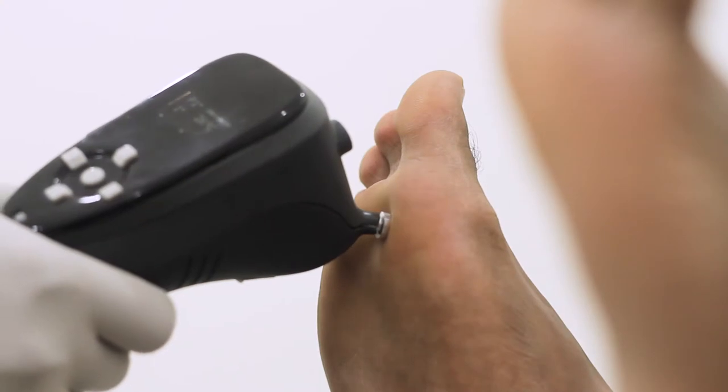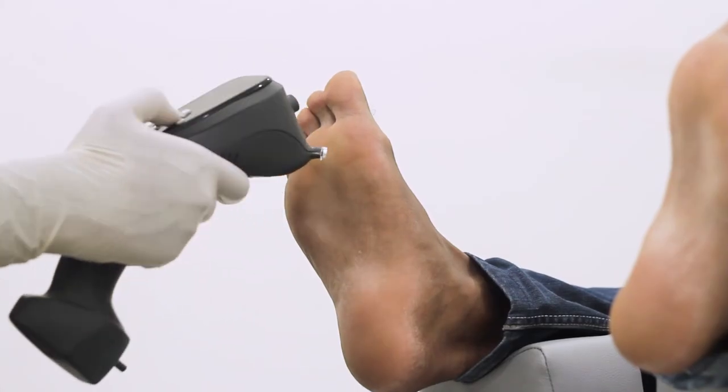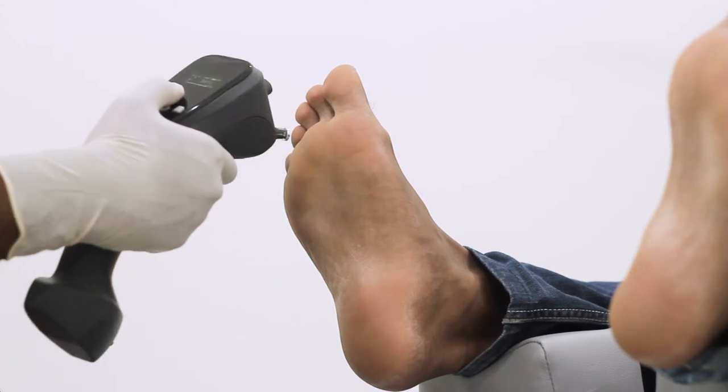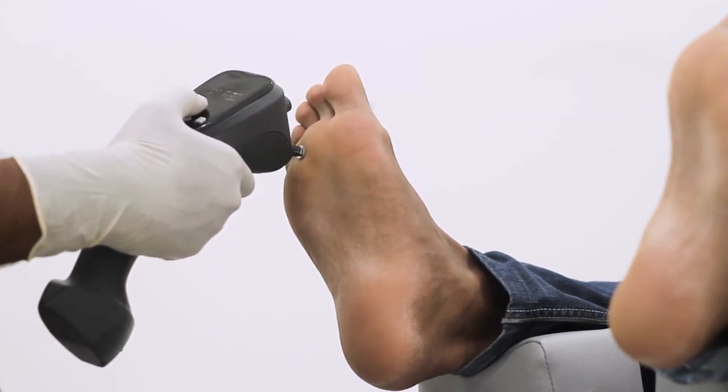Gently push the points on the subject's feet with the hot probe. Take constant feedback from the subject about the feel of the temperature and modify the temperature accordingly. Always wait for the probe temperature to reach the desired set temperature.